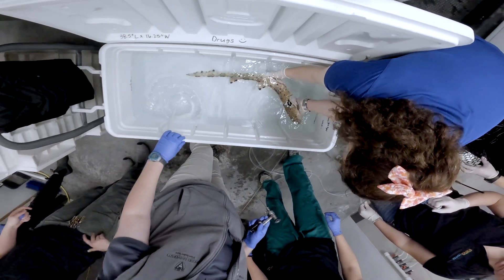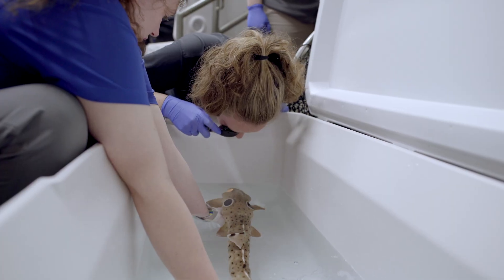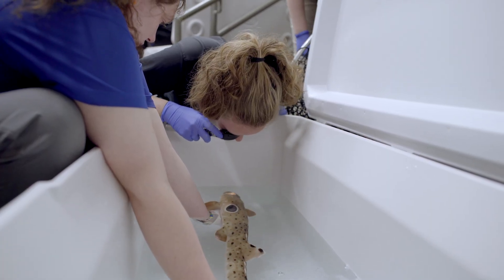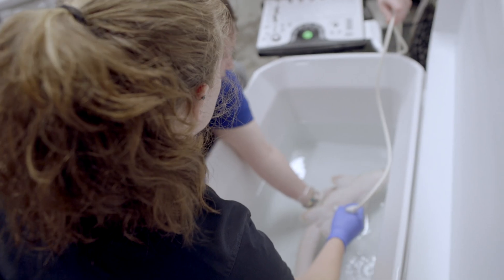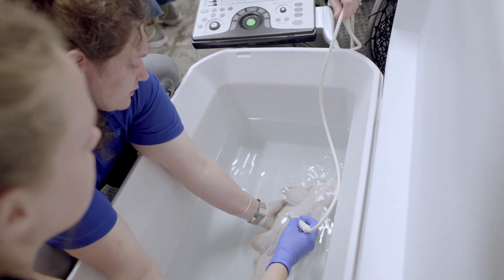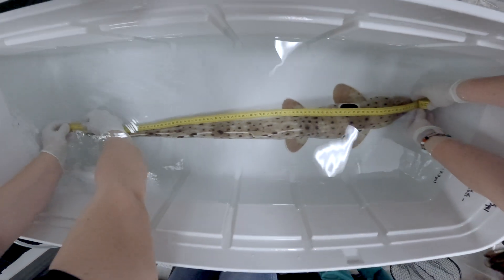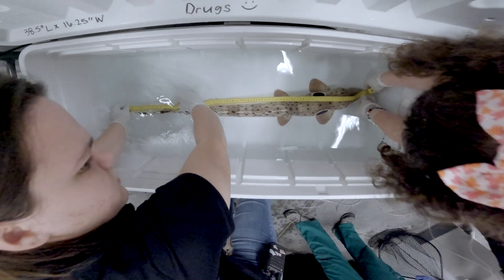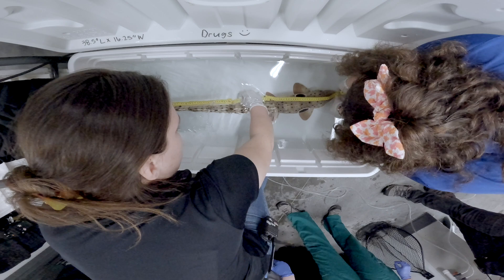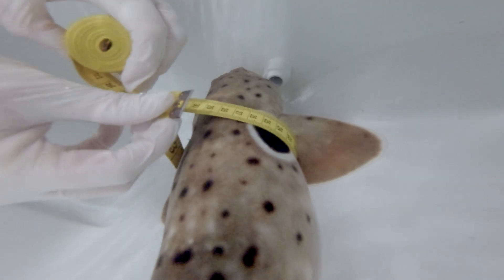As long as everything looks good and we see no issues, we'll go ahead and move that shark into the recovery tank — a tank that has no medications in it — and the shark can start recovering because that takes a little bit of time. We can do the rest of our exam there, which includes palpation, ultrasound, looking at the eyes, and getting body lengths as well as girth measurements around the shark.